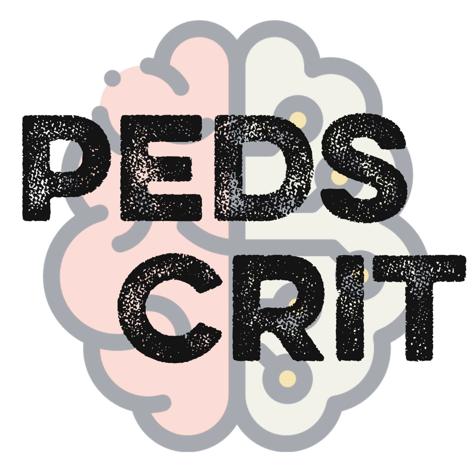I think one pitfall to acknowledge here is that when we incorporate modes of ventilation that not everyone is comfortable with, there is the potential to slow things down for these patients. And it seems like locally, you likely have lots of institutional knowledge and familiarity with NAVA. And I would imagine that really helps implement this mode of ventilation and progress kids along. And for listeners who are thinking about incorporating more of this in their practice, it would take a considerable amount of education to be able to support these patients the best possible.